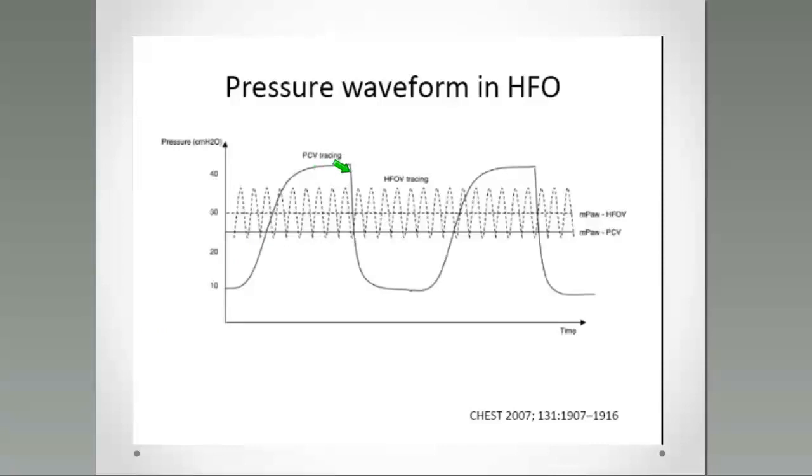For conventional mechanical ventilation, the pressure goes up until peak inspiratory pressure and then goes back again to the end expiratory pressure. This increase in the pressure is going to generate tidal volume movement into the lungs, and this tidal volume is going to reach the alveoli. Then you are going to have this exchange of gas in the lungs.